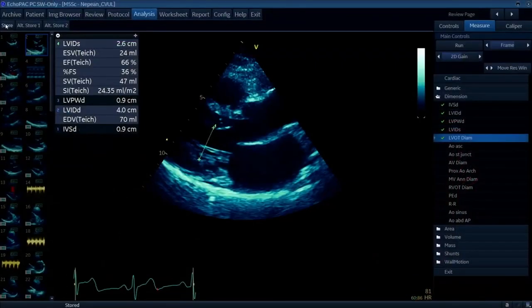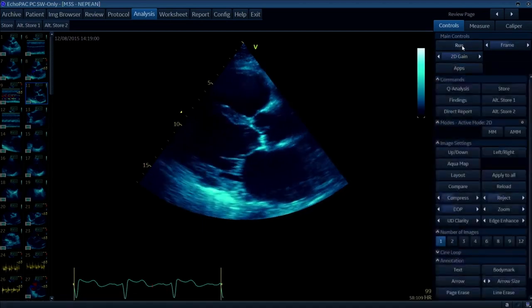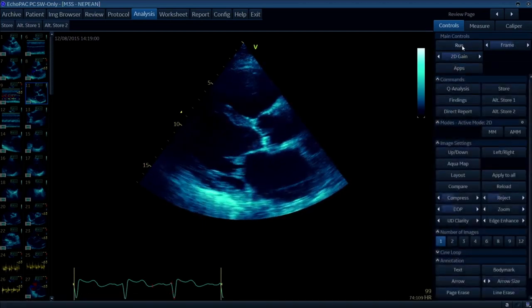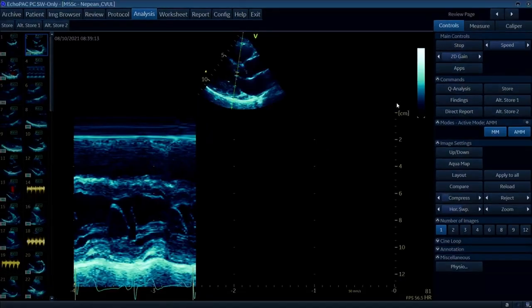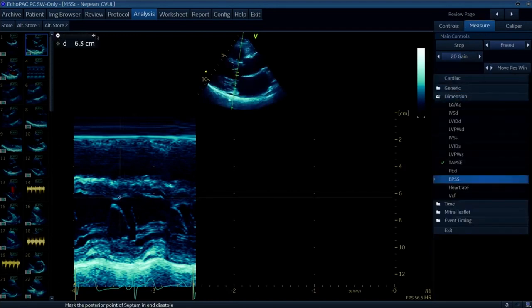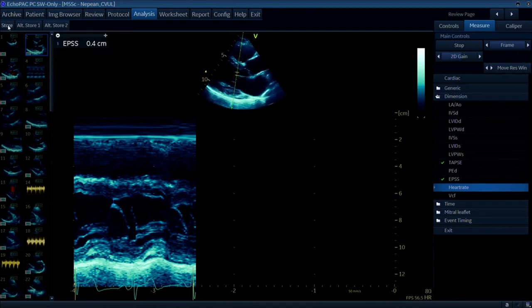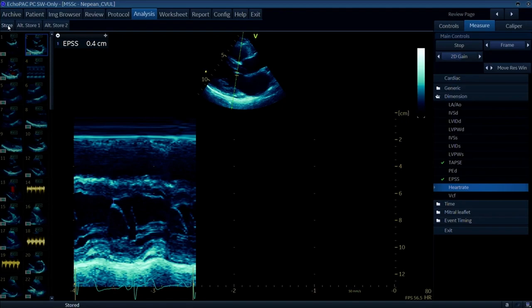The other measurement that people like to talk about in the parasternal long axis view - particularly in the emergency population - is something called E-point septal separation. This is where you measure the distance between the maximal anterior movement of the anterior mitral valve leaflet and the septum. We're measuring that distance between the excursion of the anterior mitral valve and the septum - the closer it gets to the septum, the better the systolic function of the LV is theoretically. A normal value is anything less than six millimetres.